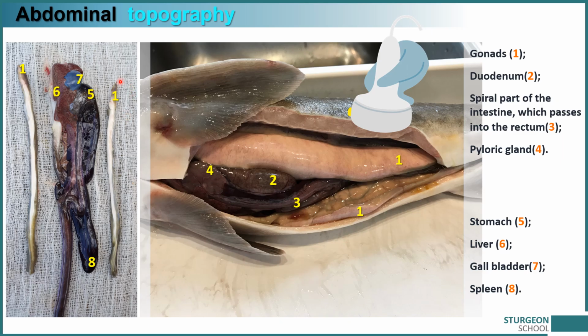It is most likely impossible to identify the sex of such fish, and it is difficult to simply capture a gonad of this size with a transducer. On the right, the gonads of a mature male sterlet. Diagnosis at this stage will not be difficult.